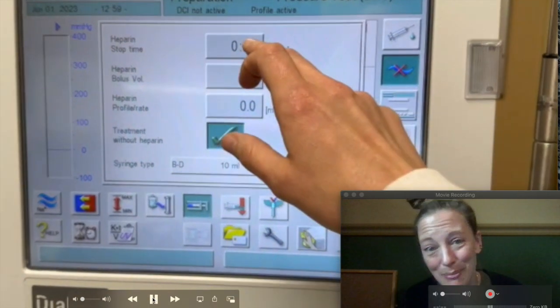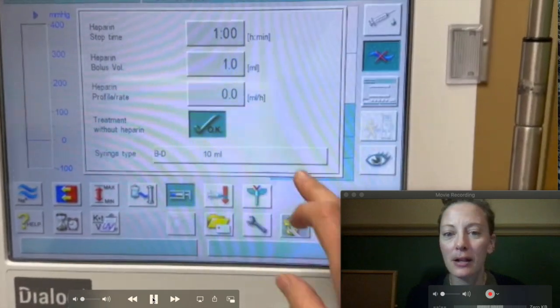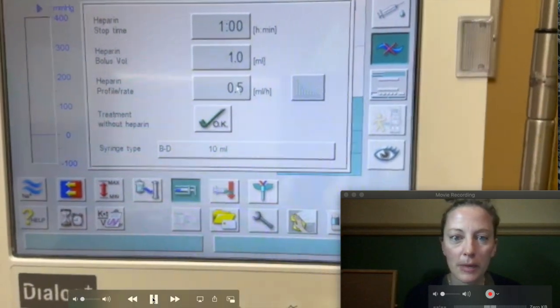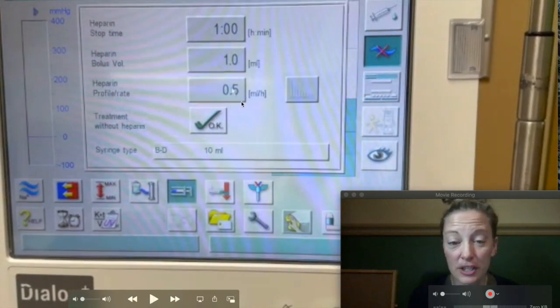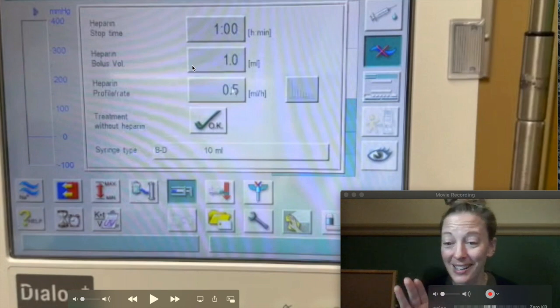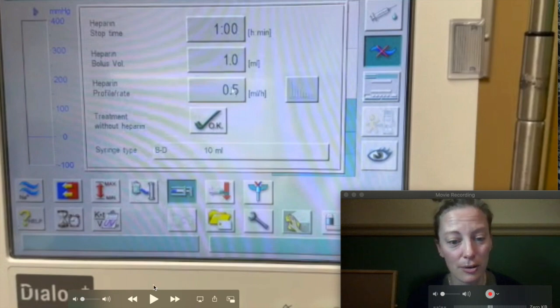Stop time: one hour. I'm going to do a bolus of one mil. Generally the heparin, at least where I'm working, is 1,000 units per mil. It's a pretty standard, pretty common heparin order where we give them a one-mil bolus. And then if they have a fistula, we're going to stop heparin with an hour left, right? Because if we're giving them heparin through their whole treatment and then I take out their needles, they're going to bleed. So most of our fistula patients and graft patients, the heparin stop time is one hour or a half an hour, so they don't bleed so much when we take those needles out. If they have catheters we have clamps, so those catheter patients generally have a stop time of zero from my experience.